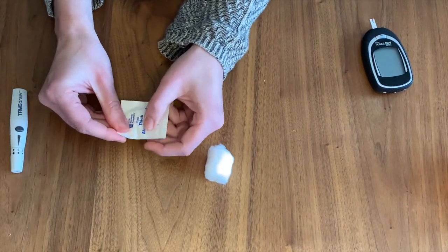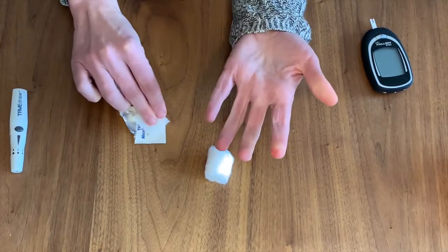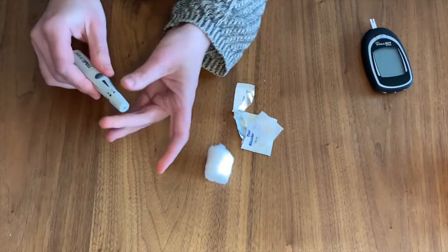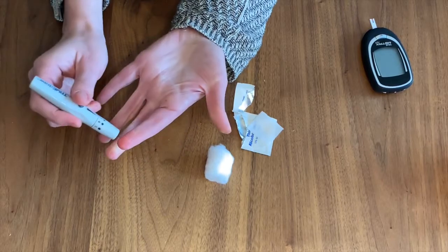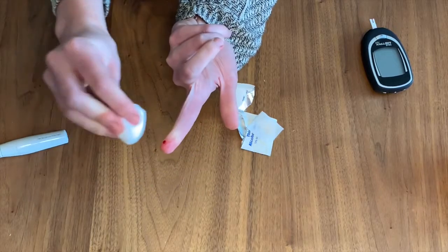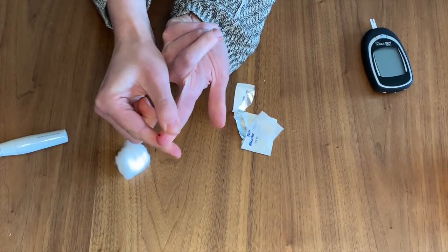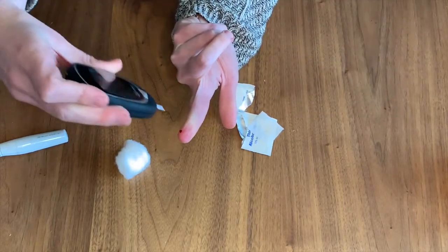If you cannot wash your hands, clean your fingertips with alcohol. If you do this, make sure you let the fingertip dry and remove the first drop of blood you get with a gauze or a cotton ball, not the alcohol wipe. You will then get a second drop of blood and use that for the test strip. This will minimize contamination of the blood drop with alcohol, which can give you a falsely low reading.